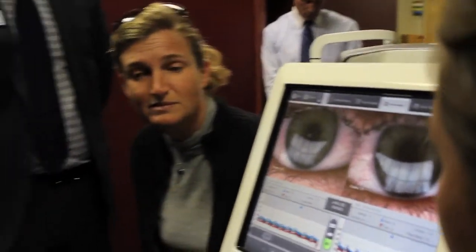So basically, the doctor will then look at the numbers here, and it calculates, and it kind of gives him a grading system. So right there, he sees that, educates the patient on that, and puts that as a permanent part of their file. They could have a copy of this as well. And then from there, he's going to go ahead and look closely now, just like those pictures you saw up on that screen, at those glands. And he's going to actually grade those secretions that are coming out.